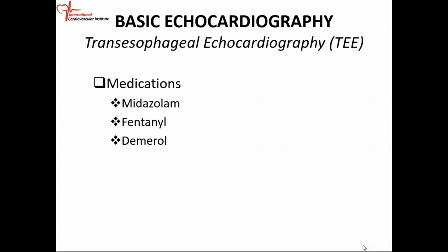So that's becoming very popular now. So we would do a transesophageal echo to look at the left atrial appendage, size the left atrial appendage so that we can put in this device. So we're going to spend a little time looking at those different features.